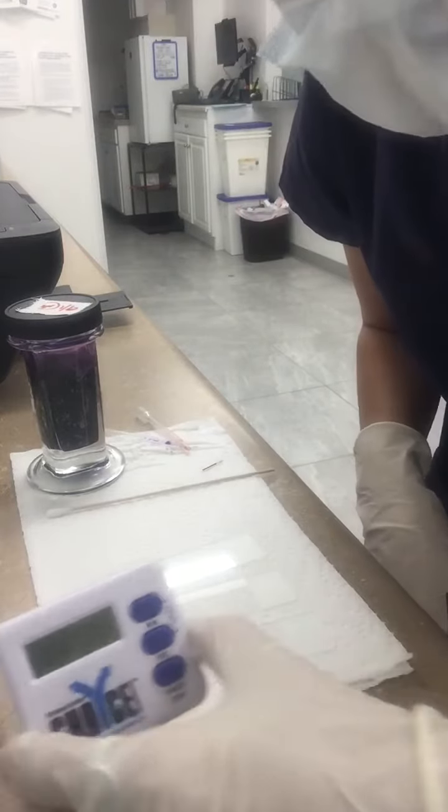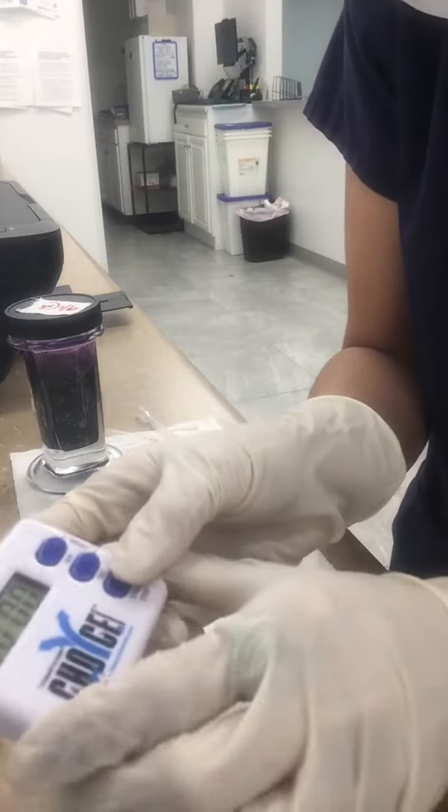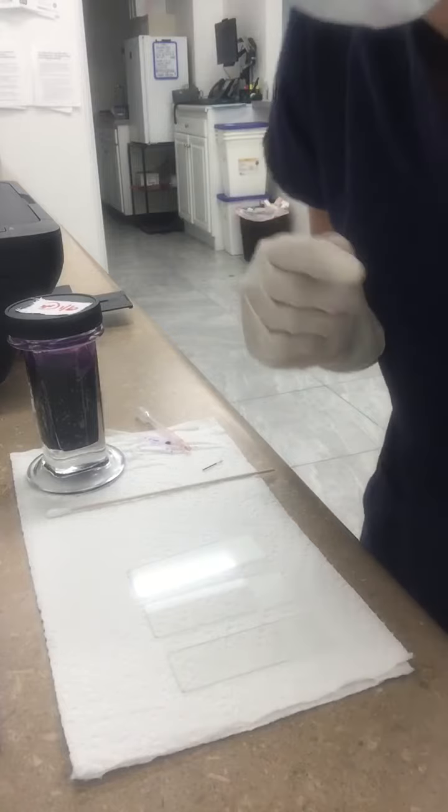We are back and my timer is going off — 10 minutes has passed. We're going to go ahead and turn the timer off. Let me go grab my sample.